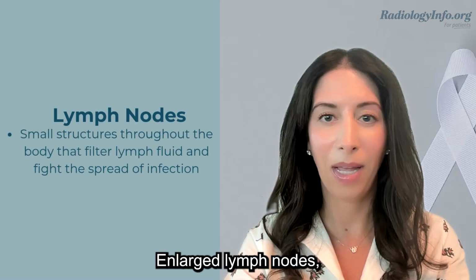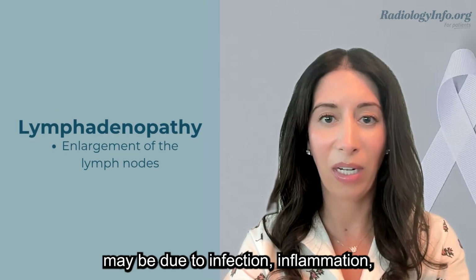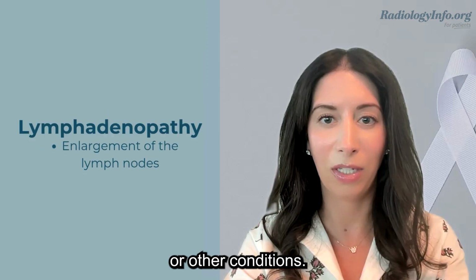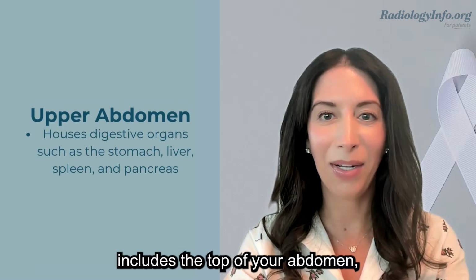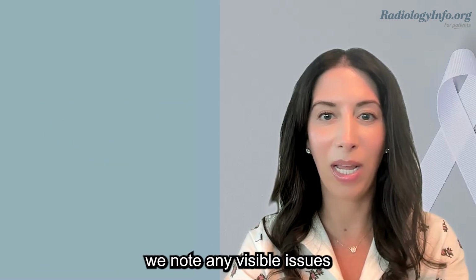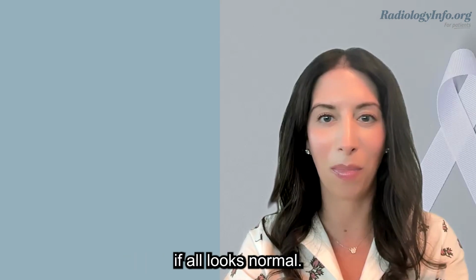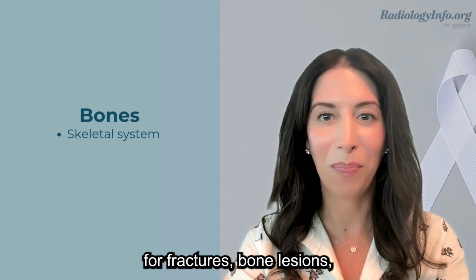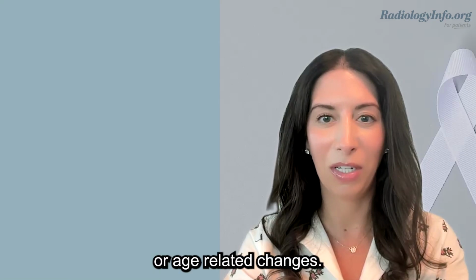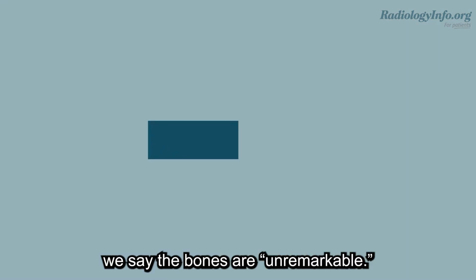Lymph nodes. Enlarged lymph nodes, also called lymphadenopathy, may be due to infection, inflammation, or other conditions. Upper abdomen. Since the scan includes the top of your abdomen, we note any visible issues, or simply say it's unremarkable if all looks normal. Bones. We look at the bones for fractures, bone lesions, or age-related changes. If nothing stands out, we say the bones are unremarkable.